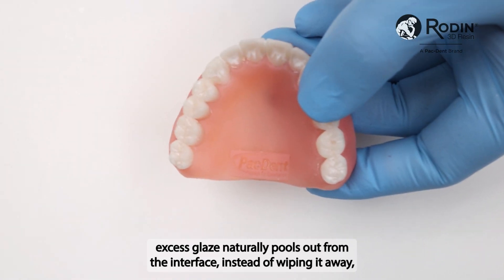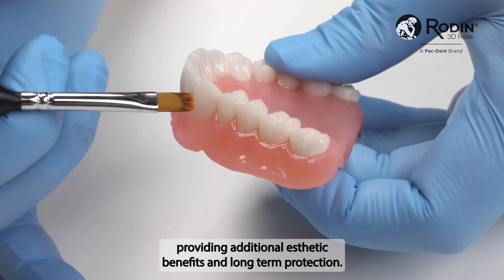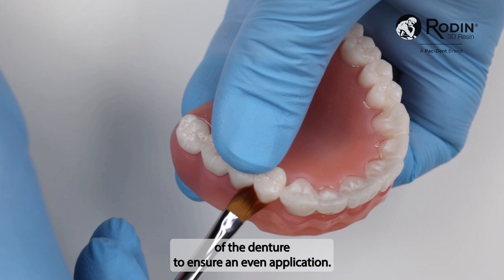Instead of wiping it away, use the excess glaze to coat the denture, providing additional aesthetic benefits and long-term protection. Brush downwards towards the bottom of the denture to ensure an even application.